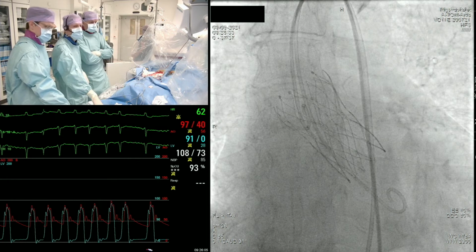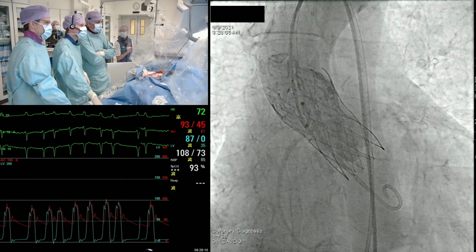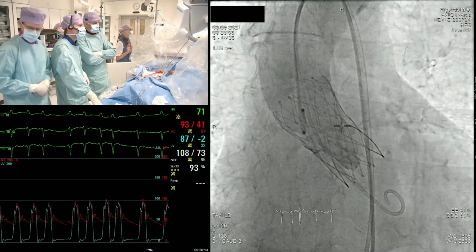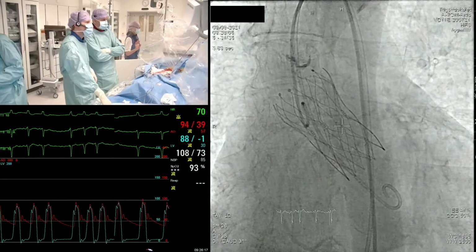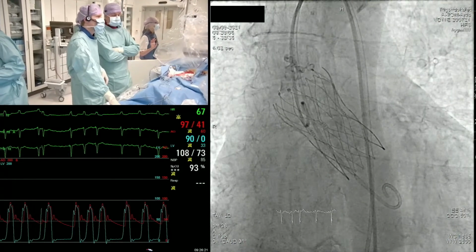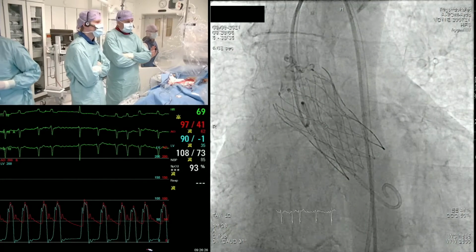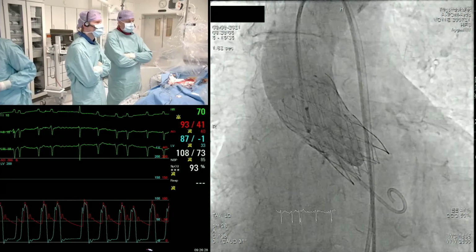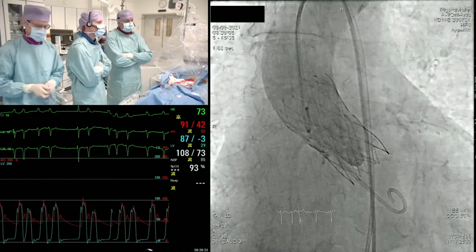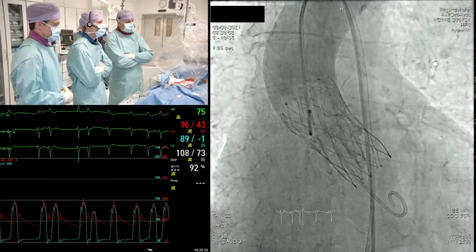Exactly, have severe commissural misalignment. So let's do an injection here. Yeah. And I think we have a very nice position. Yes, we are where we want to be, about those 3 millimeters below the aortic annulus. I don't see any paravalvular leak at all. And we have now done, I don't know, around 25 cases with this Navitor valve, and we haven't seen any patient having more than a mild PVL. And that's also aligned with what we saw in the first 120 cases presented at EuroPCR 2021.